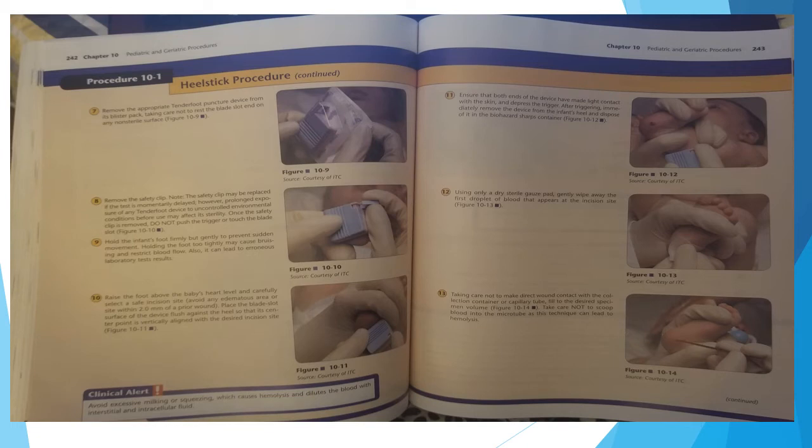Remove the appropriate tenderfoot puncture device from the blister pack, taking care not to rest the blade slot on any non-sterile surface. Remove the safety clip. Note, the safety clip may be replaced if the test is momentarily delayed. However, prolonged exposure of any tenderfoot device to uncontrolled environmental conditions before use may affect the sterility. Once the safety clip is removed, do not push the trigger or touch the blade slot.